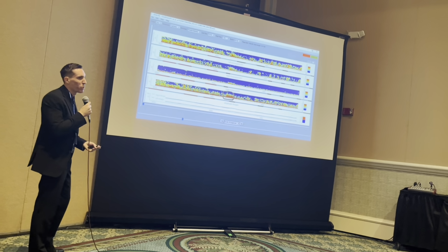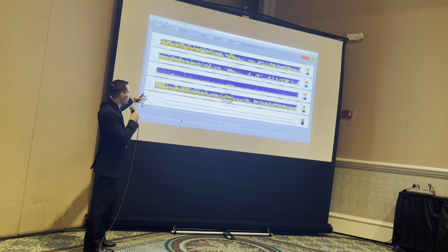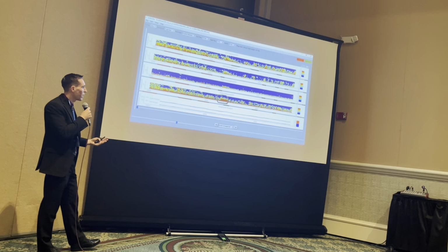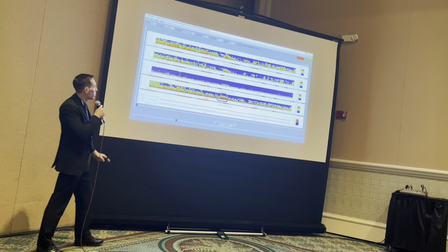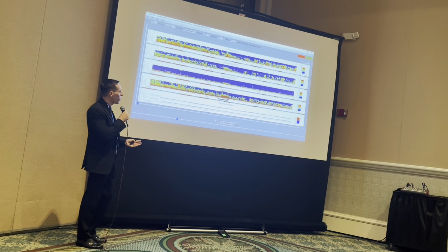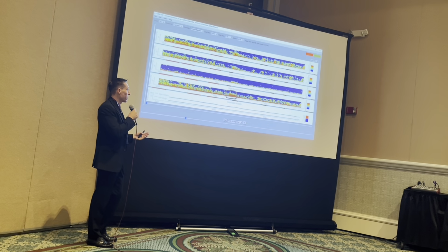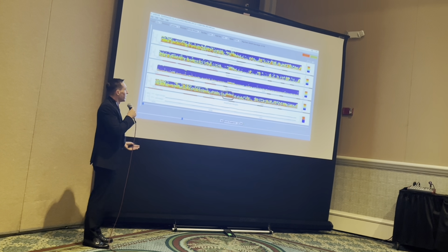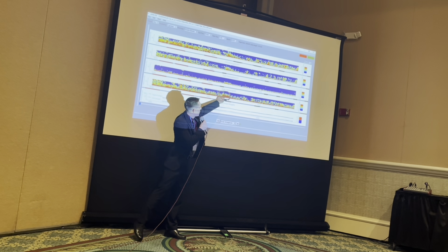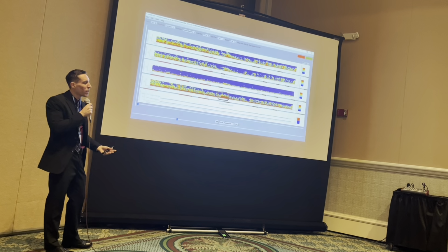Now, here's an example showing a good reason why we split it up into 4 different chains, like the double banana montage, because in this example, we were able to see a focal seizure. As I said before, seizures on quantitative EEG are represented by flames. In this example, in the right temporal region, you're going to see a subtle little flame.